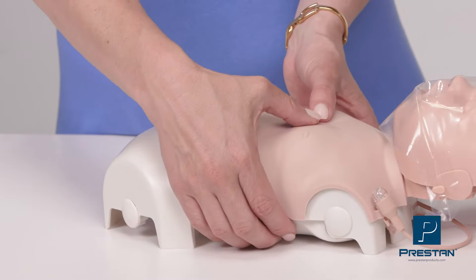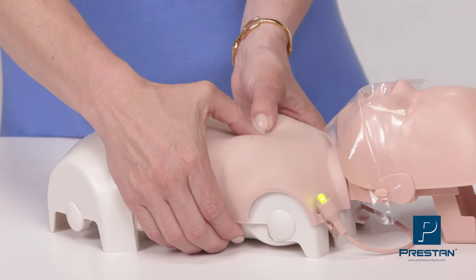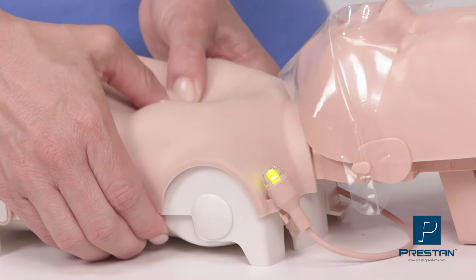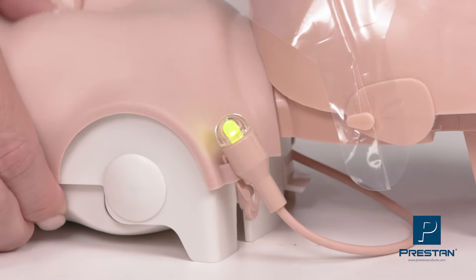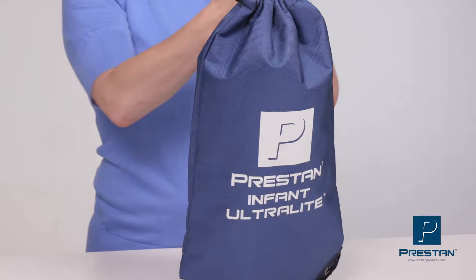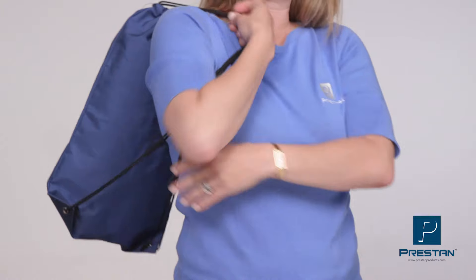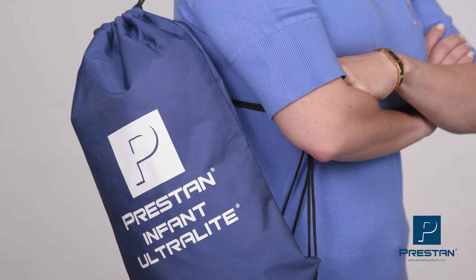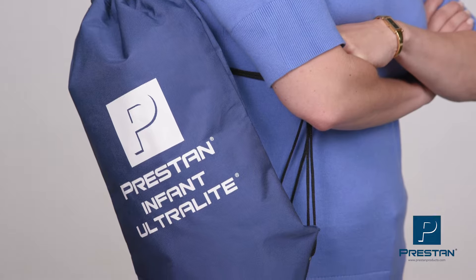The feedback piston allows for realistic chest compression resistance and depth, while the LED light provides feedback on compression rate. The compact, lightweight design allows for easy transport and cost-effective shipping, making the Preston Infant Ultralight Mannequin an ideal solution for on-the-go and virtual training.